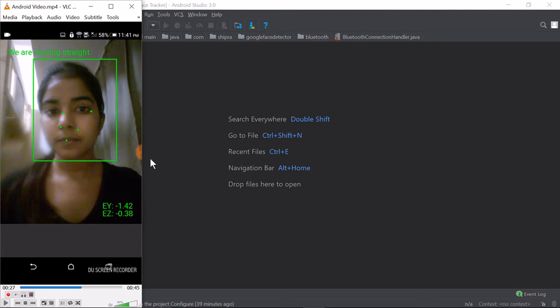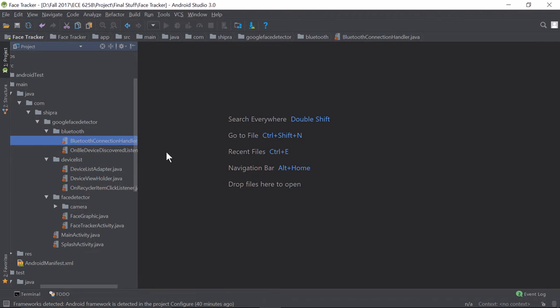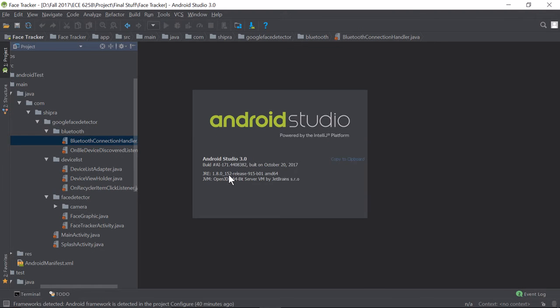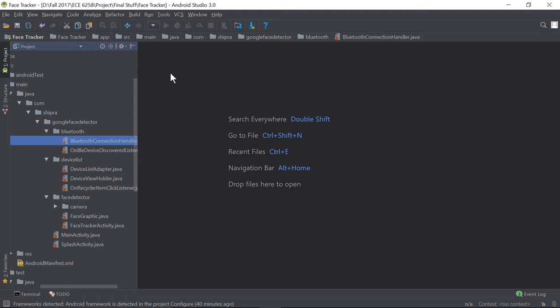Just for the purpose of the demonstration for the video and for an easy control of the Android application, we have currently disabled the Bluetooth feature. Now I'll be coming to the code. We have used Android Studio 3.0. That is what you need, and have an updated Java to run the code.